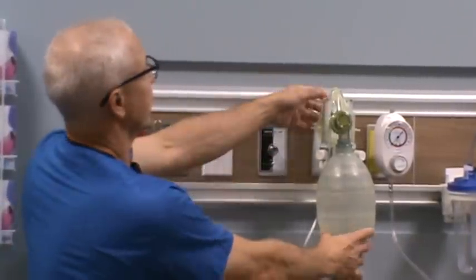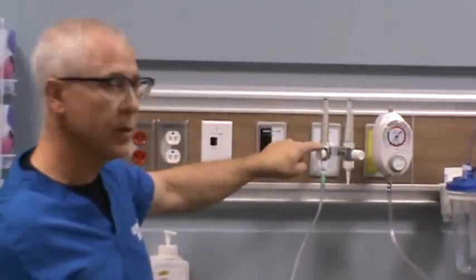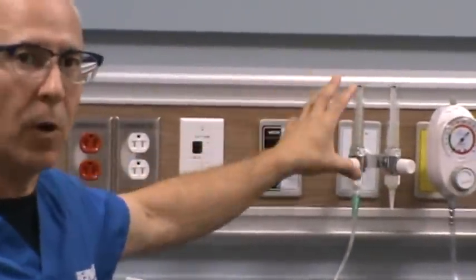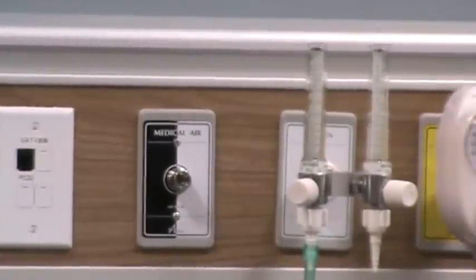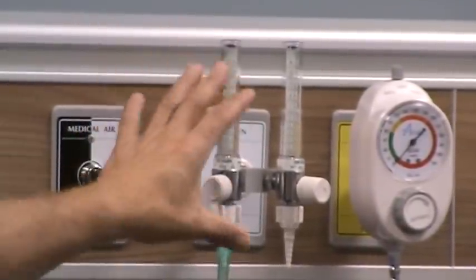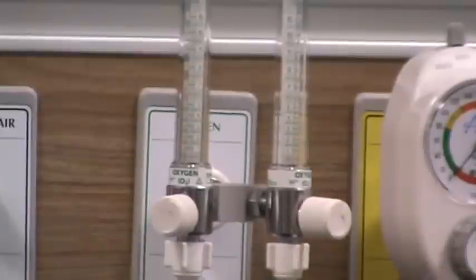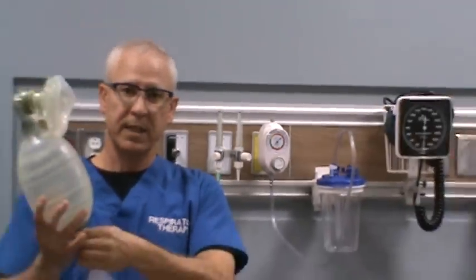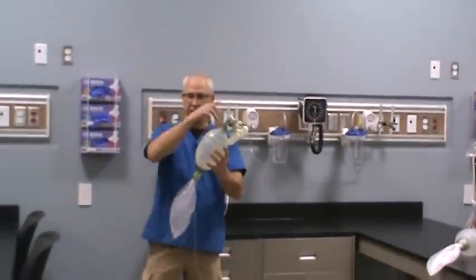We'll take the manual setup off and show you the flow meters. These are what adjust the flow coming to the device to ensure that you're ventilating your patient with maximal FiO2. We'll need the flow meters set as high as they'll go. We'll also need some oxygen tubing attached to the manual resuscitator, as well as the manual resuscitator itself in this configuration.